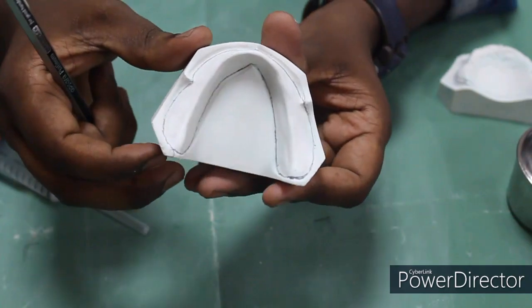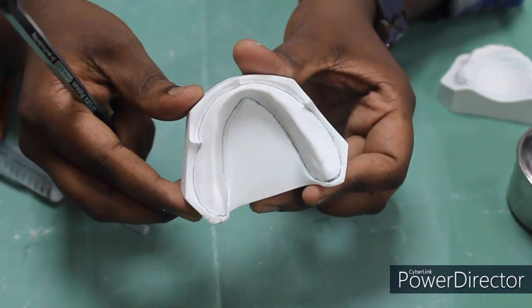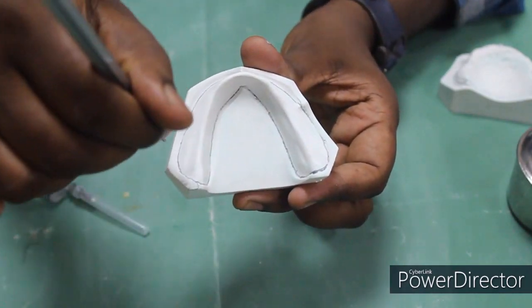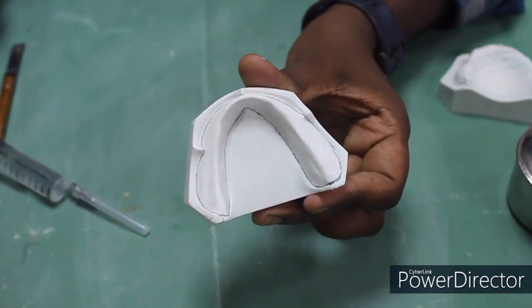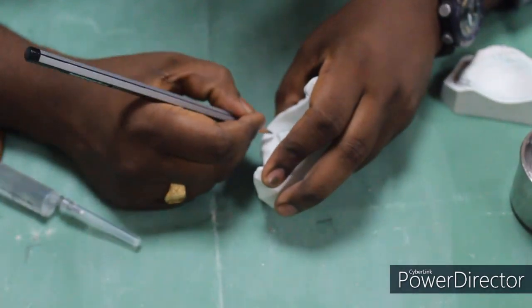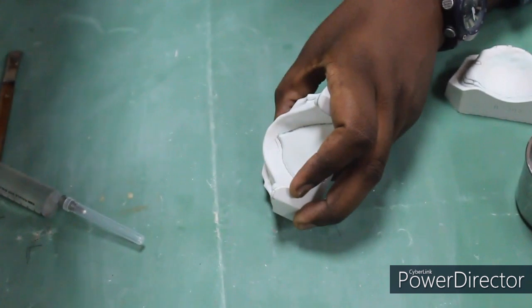Now you can visualize that we have first marked the depth of sulcus line. Is it clear? We have marked the entire region, both lingual and buccal aspect. We have first marked the depth of sulcus outline, and next I am going to draw the tray extension line. As I mentioned, it will be 2 mm short from the depth of sulcus.